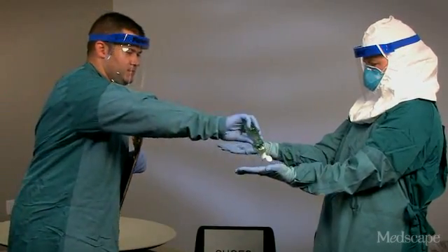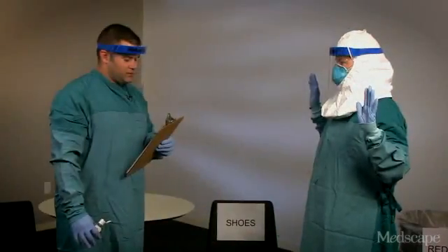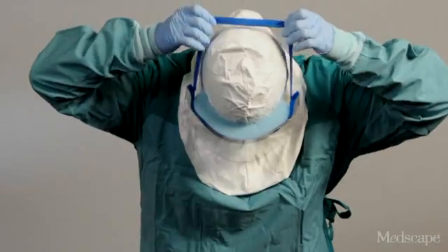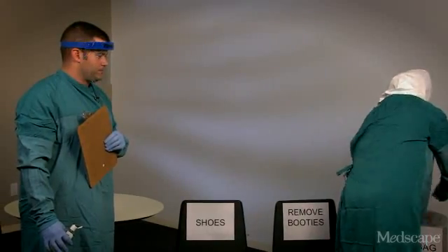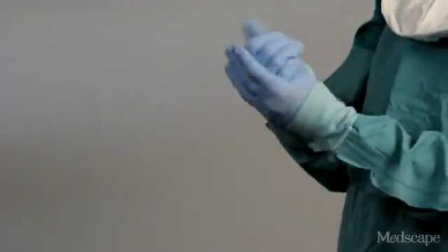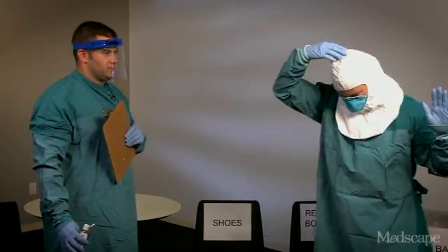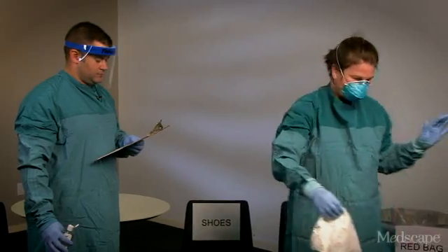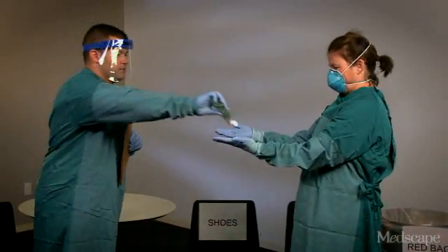Now Barbara's going to remove the face shield by tilting her head forward and grabbing the rear strap and pulling it over her head without touching the front of the face shield. Again, we're going to perform hand hygiene. In a similar fashion, she's going to tilt her head forward and carefully remove the surgical hood, grabbing from behind the head. Again, hand hygiene.